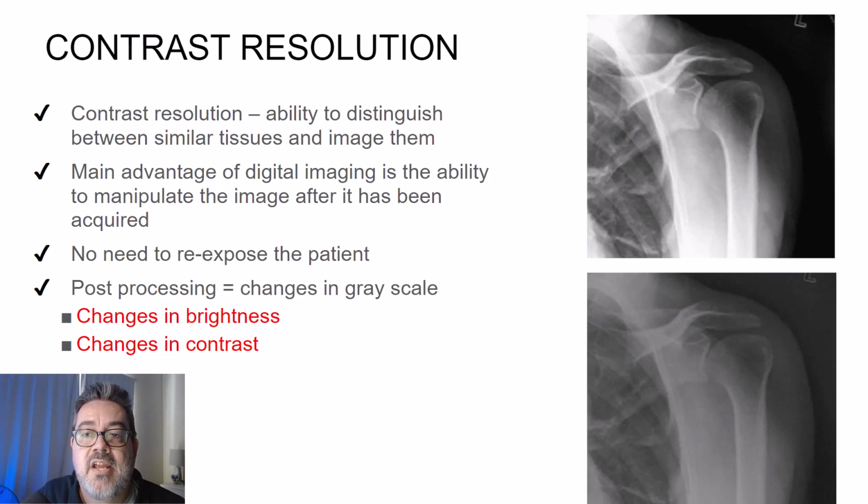Digital imaging is great because you can manipulate the image post-processing to change the contrast resolution without re-exposing the patient to more X-rays.